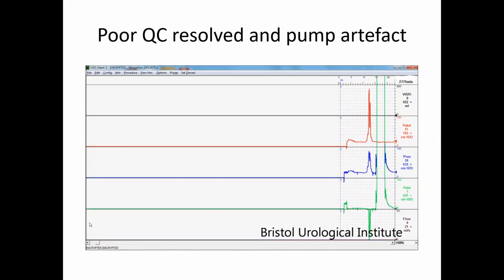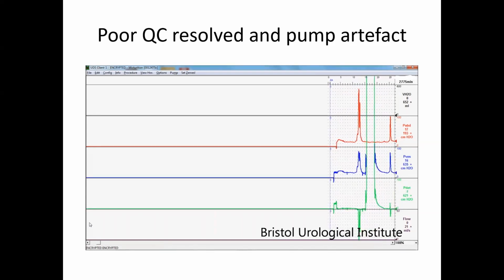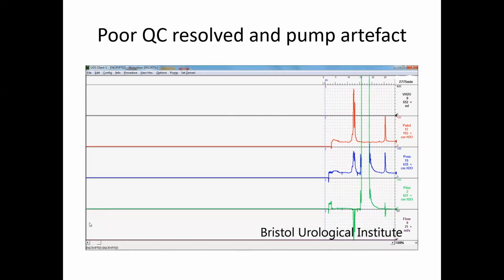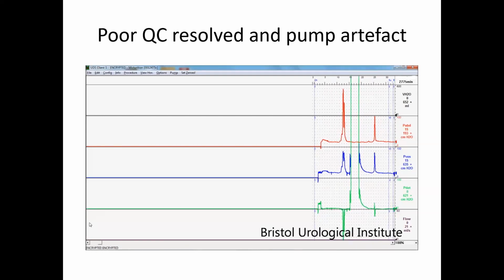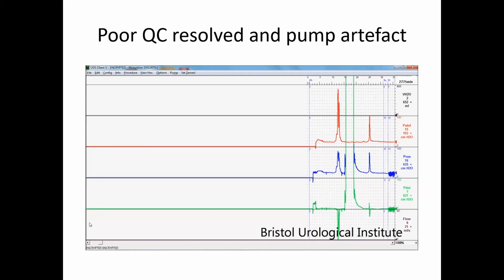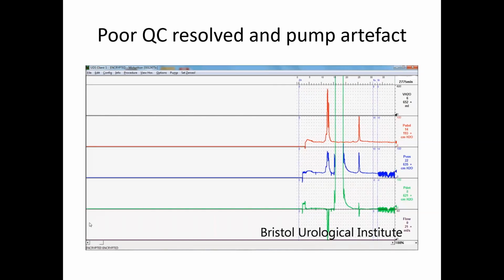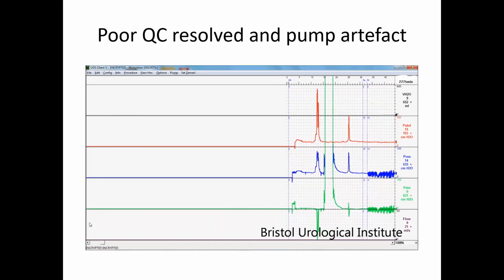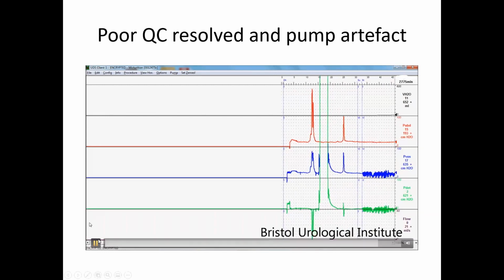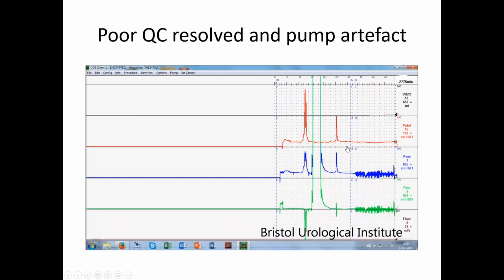In order to check that has worked, we're going to do a cough test. There's your cough test. You're happy that you've got a nice biphasic wave. And then as you start to fill your patient up, this is the pump artifact that you might get. Okay, so just to make you aware, this is what a pump artifact might look like. There's nothing you necessarily need to do. You just need to be aware that you want to stop every now and again and check your resting pressures that are sitting underneath that.